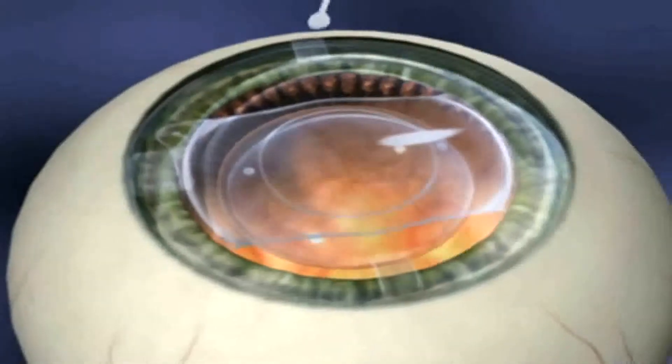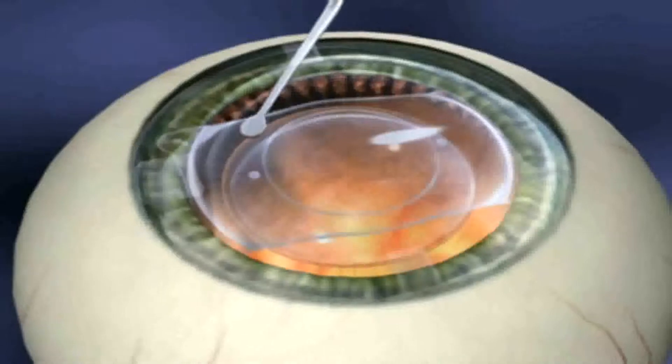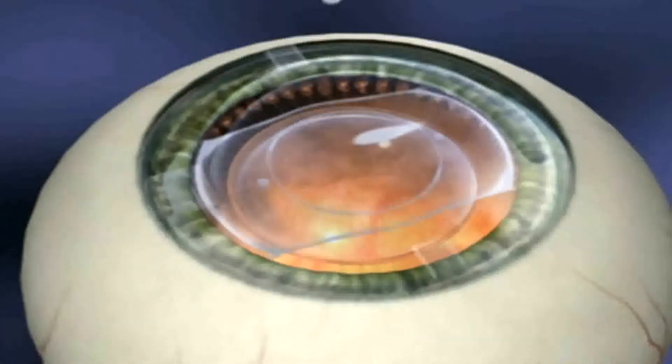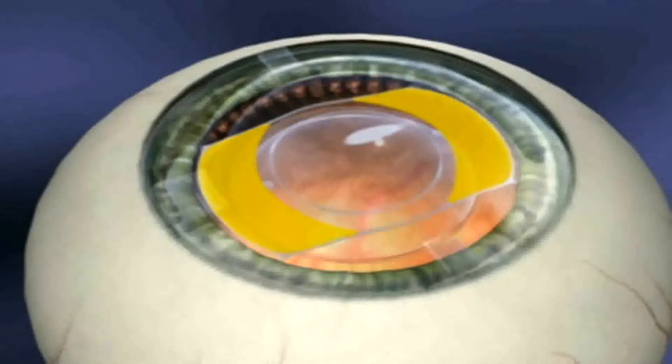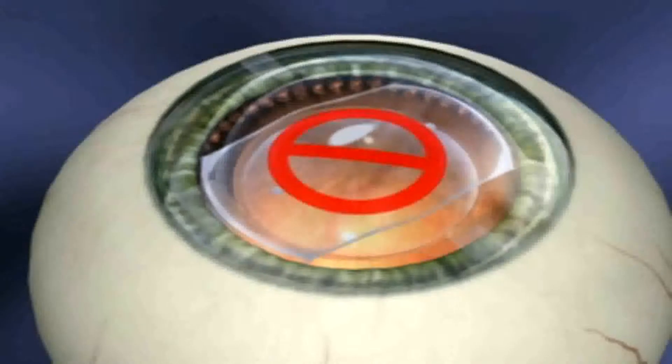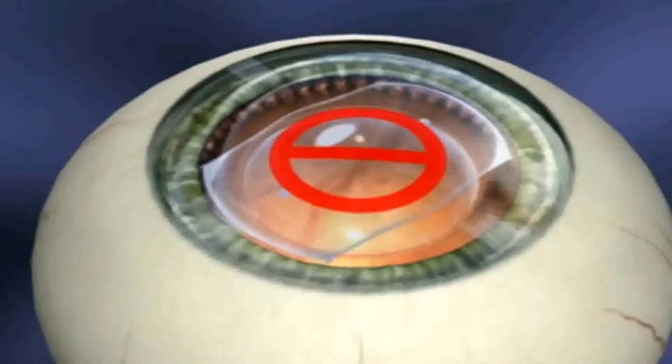Avoid excessive rotation of the ICL once it's in place. Once positioned behind the iris, subtle adjustments are achieved by manipulation on the lens body, between the footplate and optic. Never depress the optic itself — this is the thinnest part of the lens.